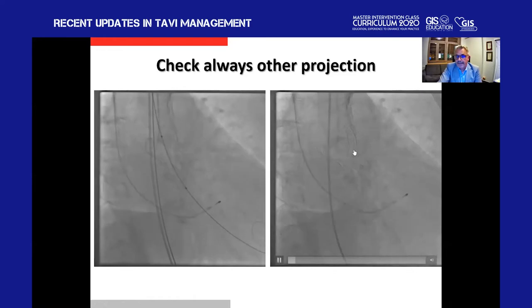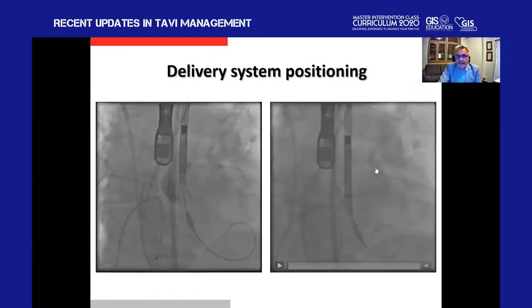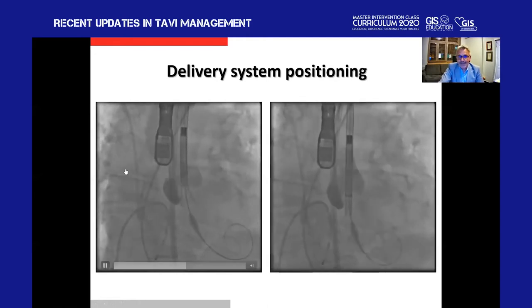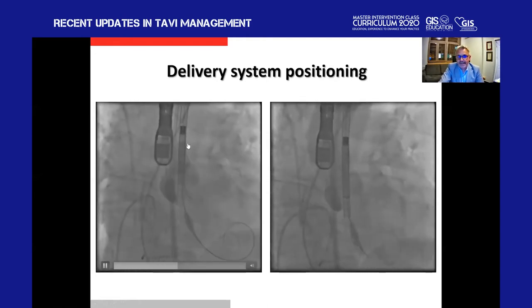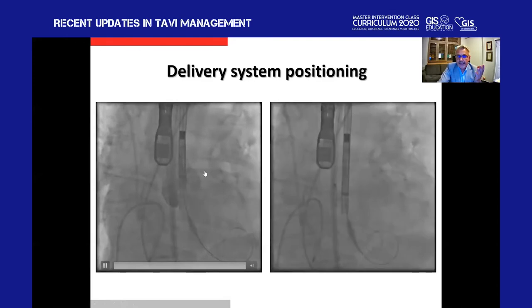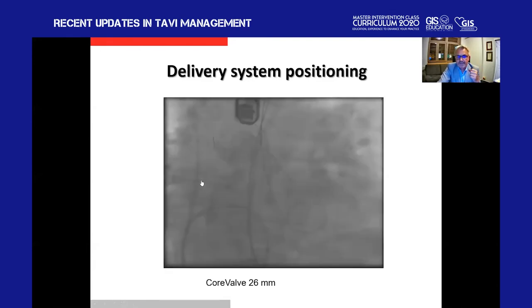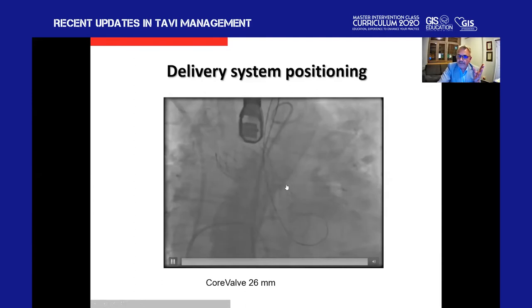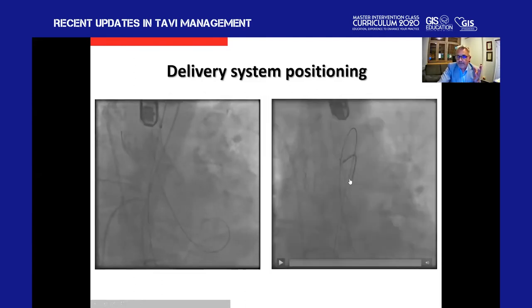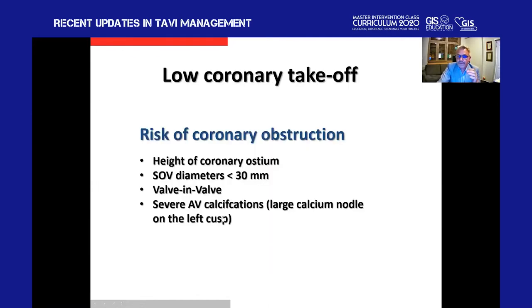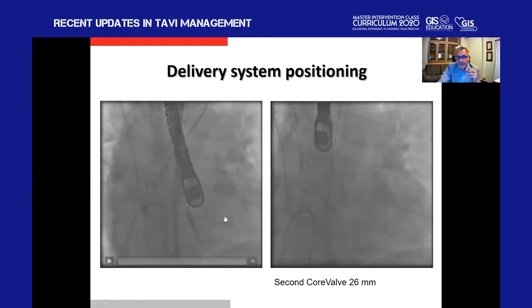Here is an example of malpositioning of the delivery system — the system is very much on the inner curve of the ascending aorta, creating much tension. This was from our early TAVI program phase and ended with the valve popping out of the aorta, requiring us to snare it and place a second valve to obtain an acceptable result. These are small but important technical issues to truly achieve a good procedure result.